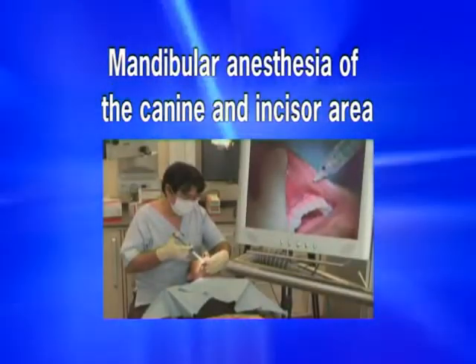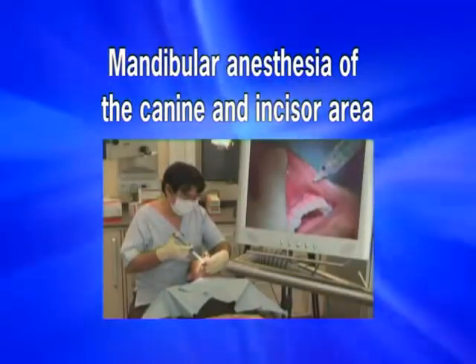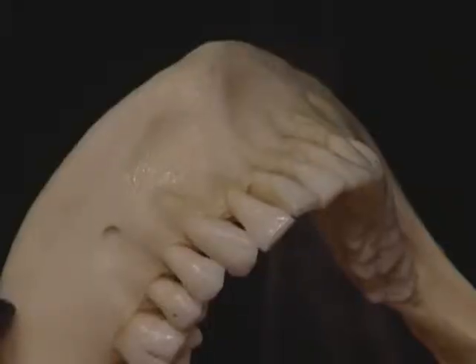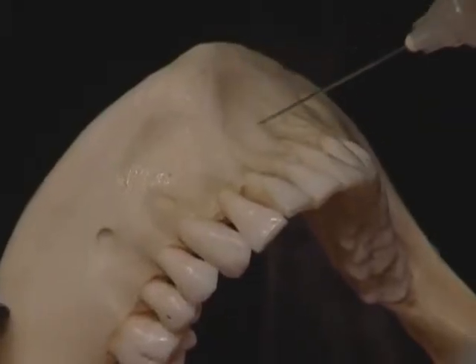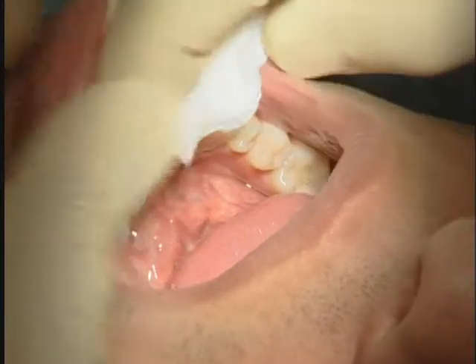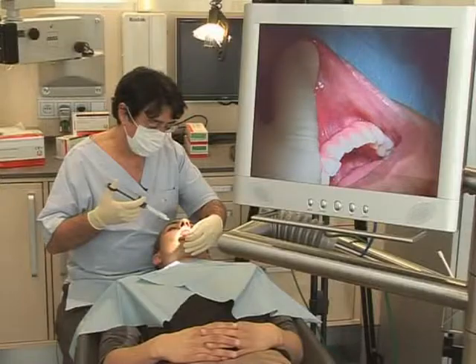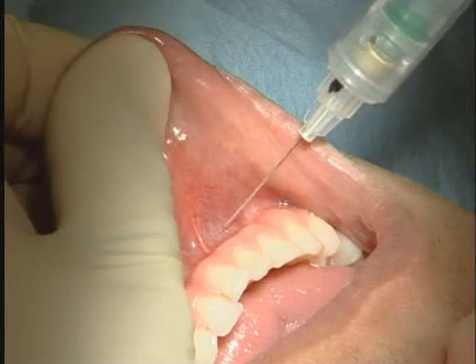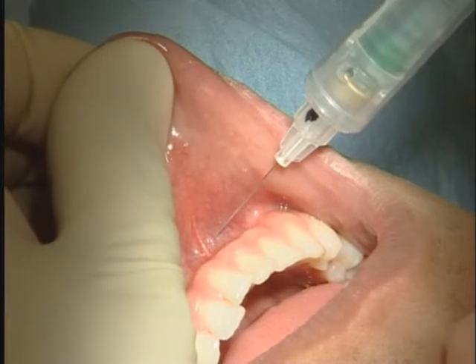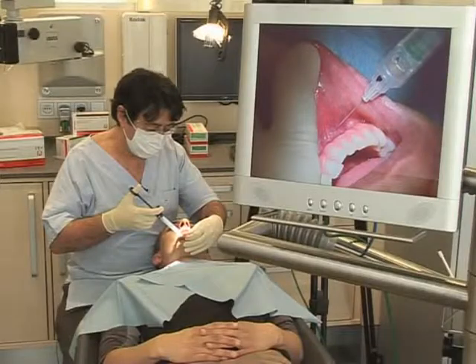Para-apical buccal anesthesia of the lower incisors and canines is usually effective as long as the tip of the needle is positioned correctly at the apex. The procedure may not be successful if the needle penetrates too deeply, as the thickness of the cortical bone is greater and obstructs the diffusion of the anesthetic solution.